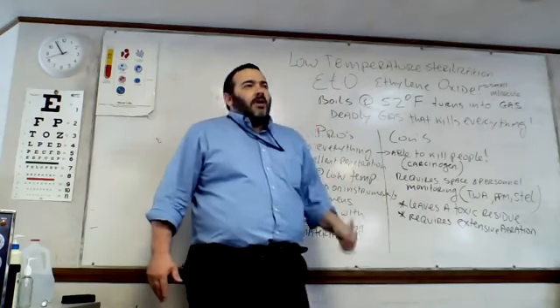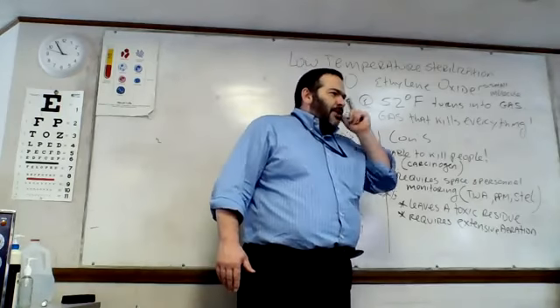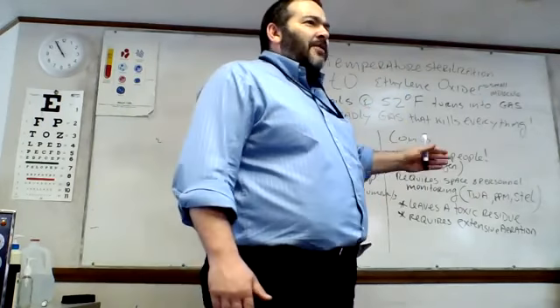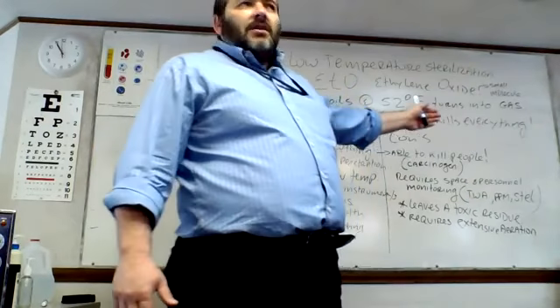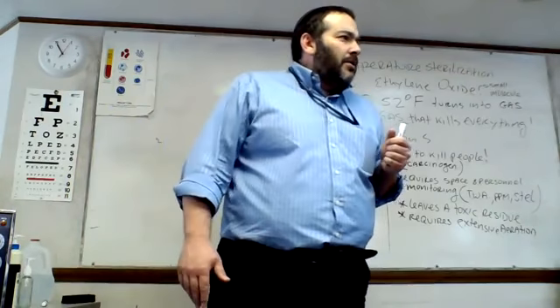Now, the process of aeration can be as long as, if I remember correctly, 12 hours. Could be 14. We'll double check later. But between 8 and 12 hours just to aerate. And the process of sterilization is 6 to 8 hours. So let me ask you a question. How long does it take for us to turn around a load?